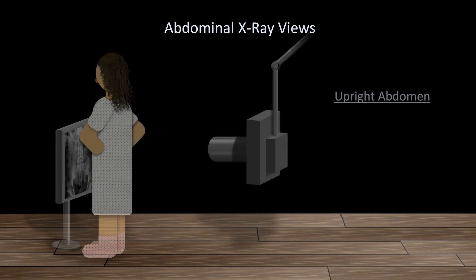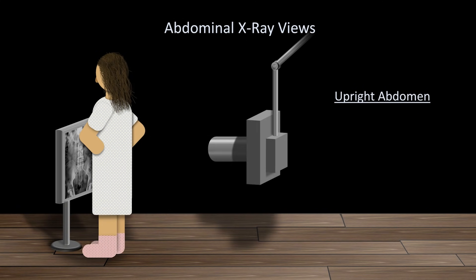Another view is the upright abdominal view. What's shown here is technically an upright PA view, in which the x-ray beam travels from the posterior to the anterior of the patient, though this view can also be taken with the patient facing forward, in which case it could be referred to as an upright AP view. But unlike with chest films, in which there is a significant difference between the AP and PA views, there is not with upright abdominal films. This view is best specifically for identifying small bowel obstructions, which is really its only major indication.